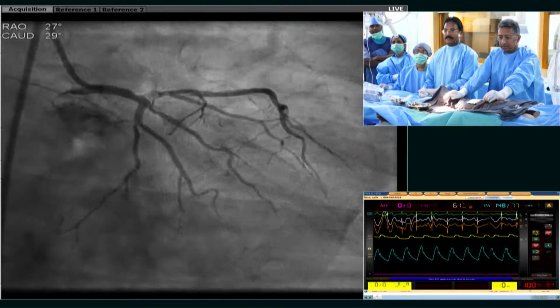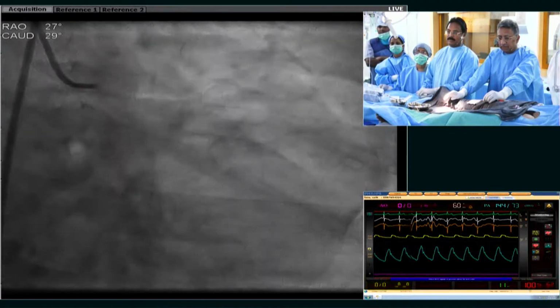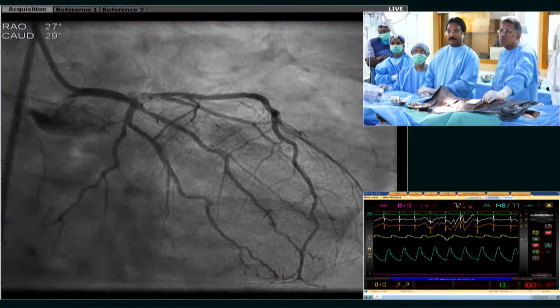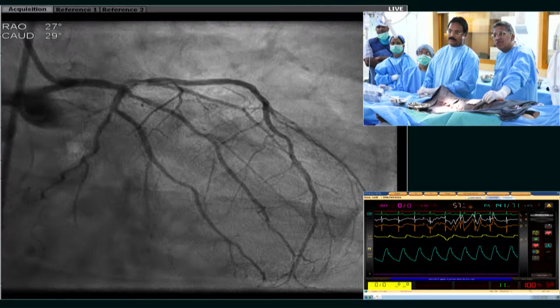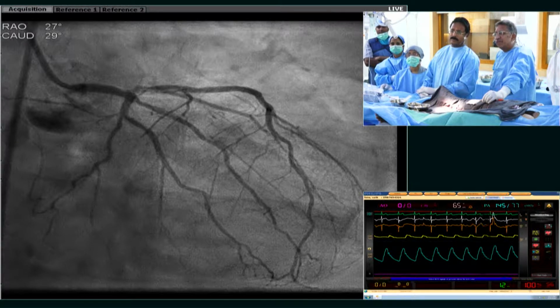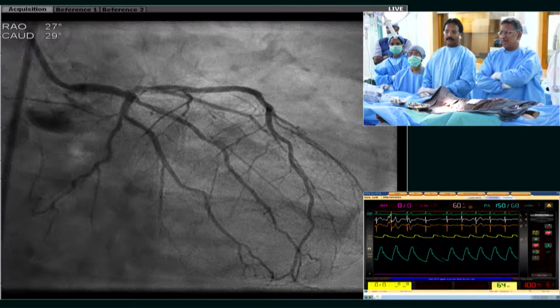Now you can see the angiography which shows a proximal left main which is okay, but in the distal left main there is some lesion, with a significant stenosis, as it appears a tight stenosis, of the LAD ostium, and down from that ostial disease there is some more disease around 20-23 millimeters down, then the LAD appears normal. And the circumflex seems to be disease free with some minor disease of the first OM.